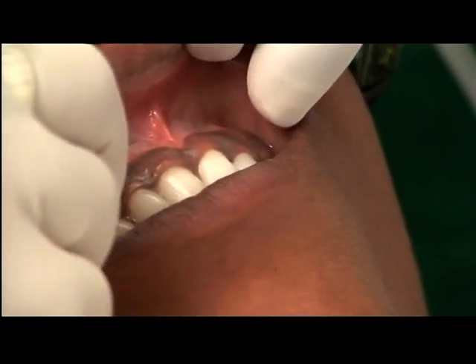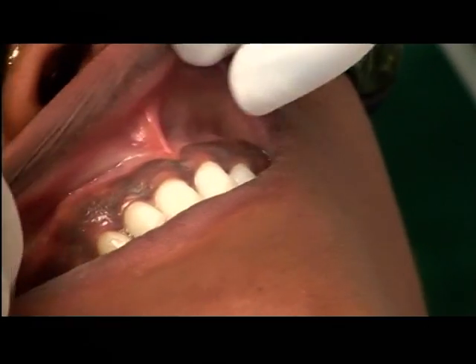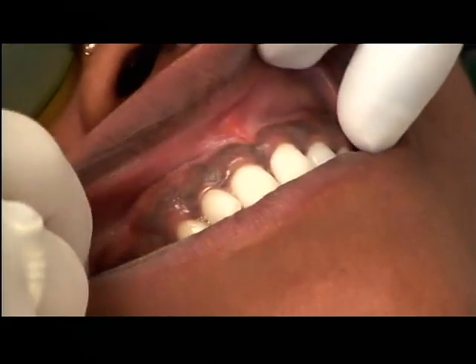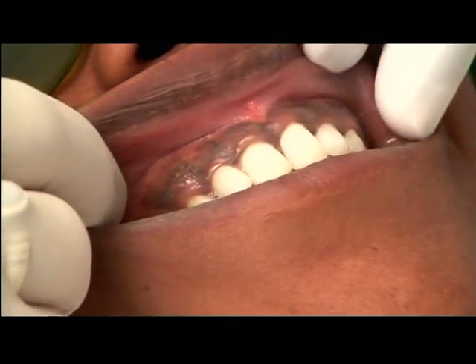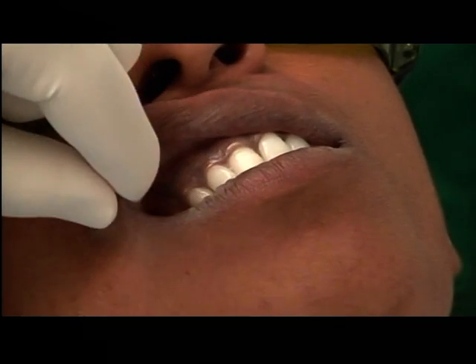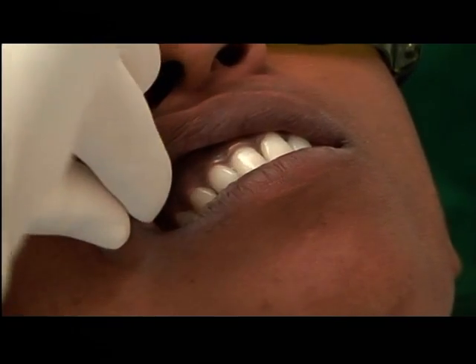We have a case for depigmentation. This is Dr. Shubda's case. I'm going to start with one side and then Dr. Ashwini will do. It is her case and her thesis topic, I think.